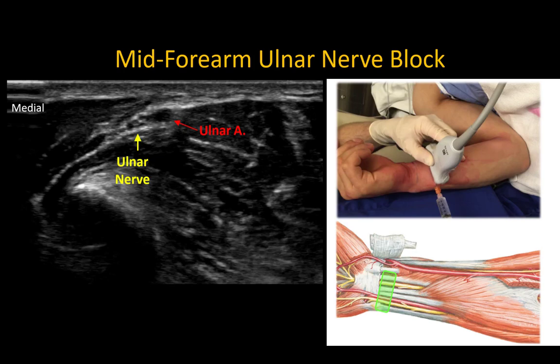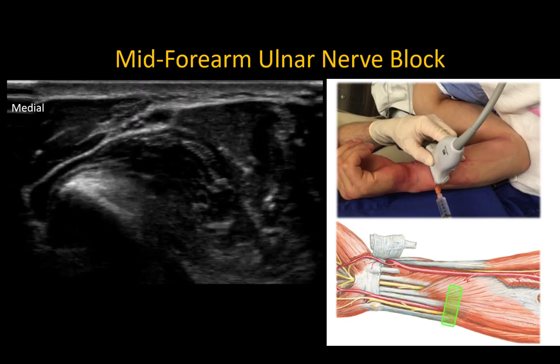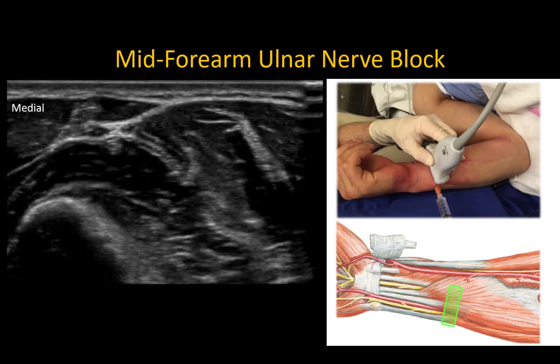Next, perform an ulnar nerve block with the forearm in the same supinated position. The ulnar nerve is easily identified by placing the probe close to the wrist crease over the ulnar artery; the ulnar nerve is always located immediately adjacent and medial to the artery. Both nerve and artery can be traced proximally to the upper forearm where they separate.